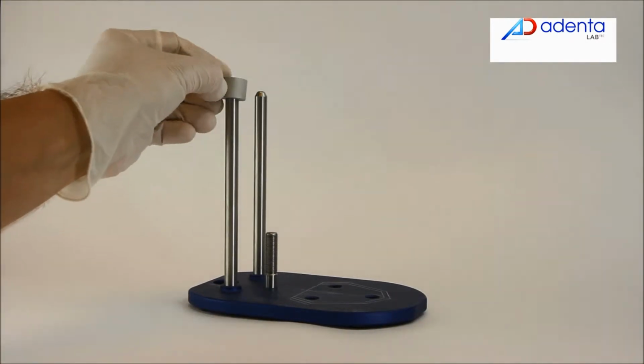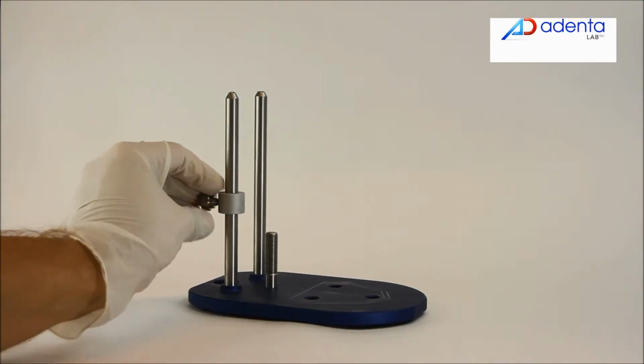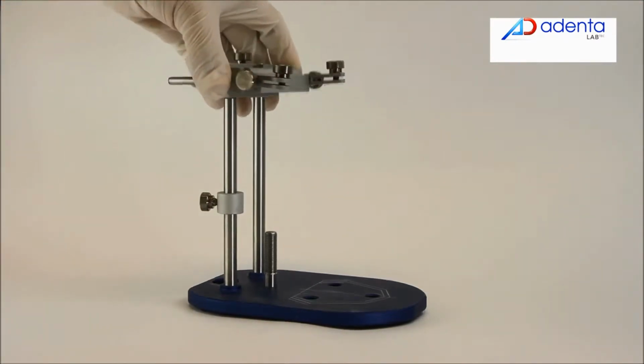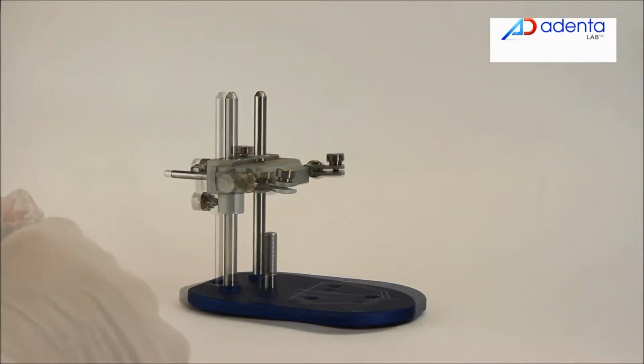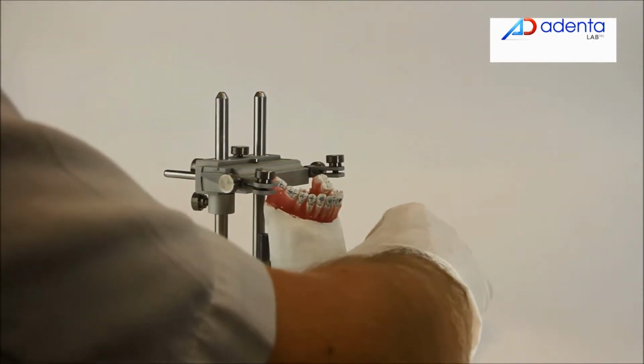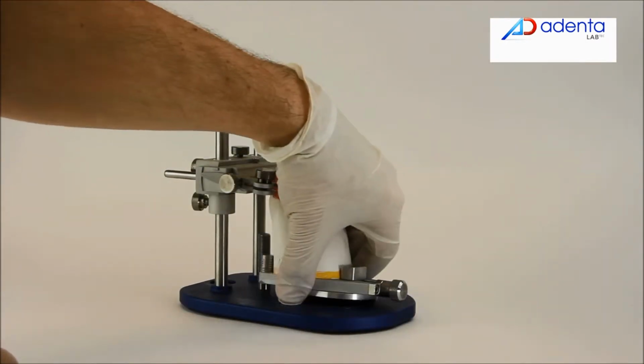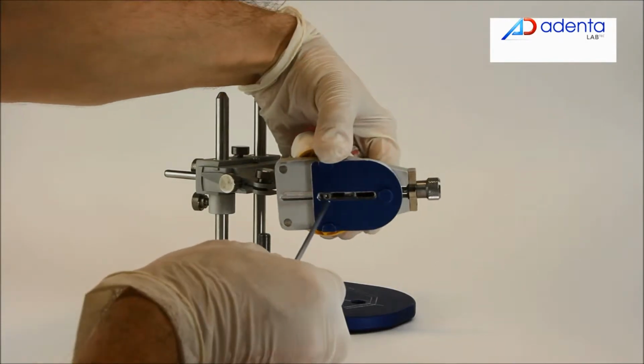With the help of easy height recording screw and multidirectional adaptation appliance, position the models on the model fixation. If necessary, adjust the antero-posterior position of the model with the fixation model adaptator, fixing the screw in the base.